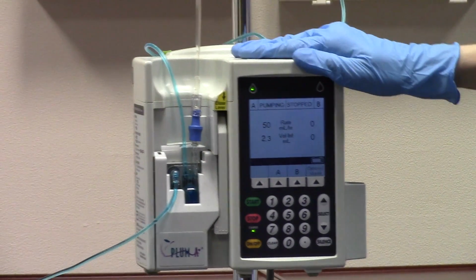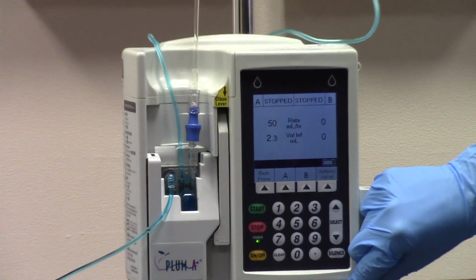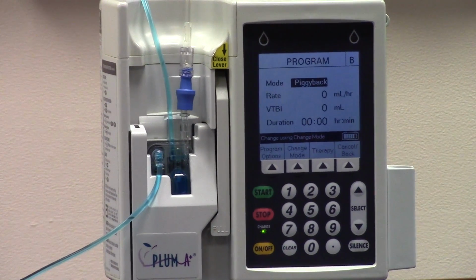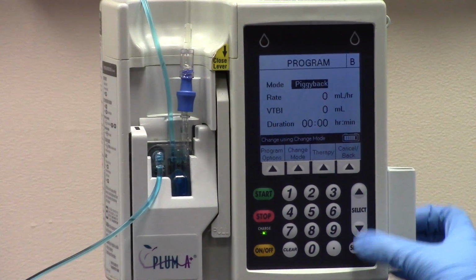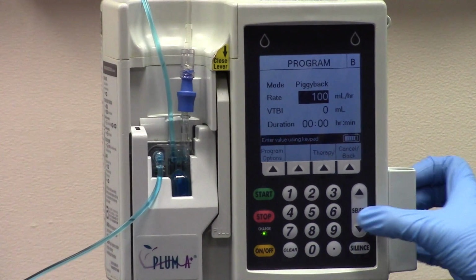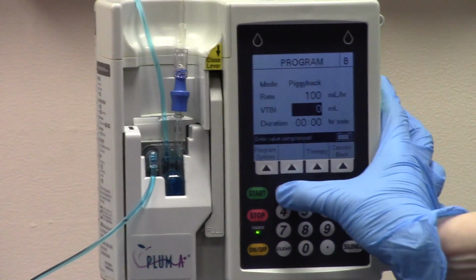So coming down to my pump, I'm going to hit stop. And I'm doing a piggyback, so now I'm going to program channel B. So channel B, I want to infuse this bag over an hour. So there is 100 milliliters in that bag. So I'm going to use my arrows. So my rate will be 100. Use my arrow again. My volume to be infused is 100.